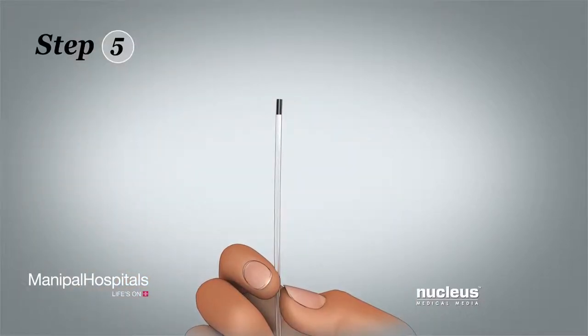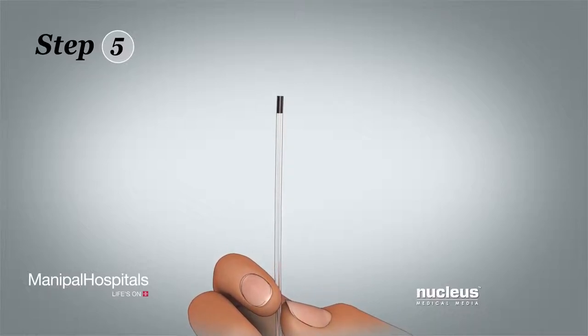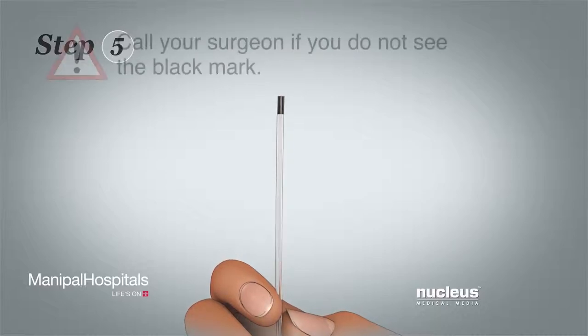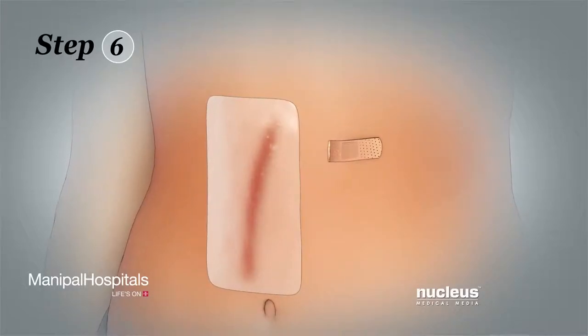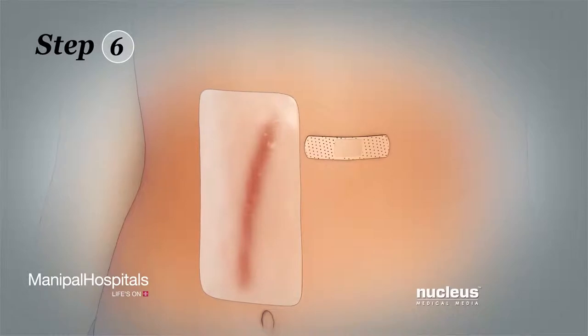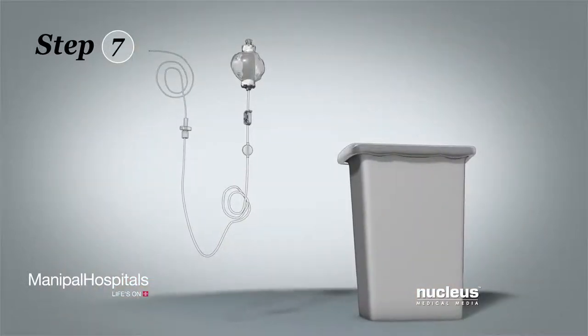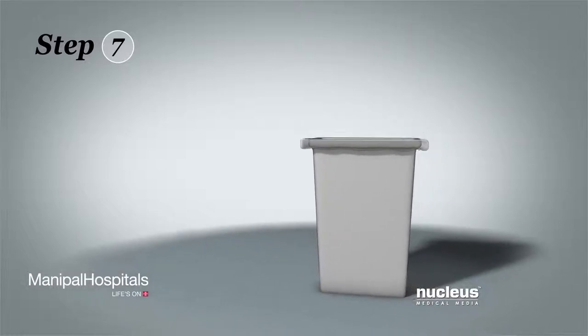Step 5: After the tube comes out, check the tip for a black mark to make sure you removed the entire tube. Call your surgeon if you do not see the black mark. Step 6: Cover the site where the tube entered your skin with an adhesive bandage. Step 7: Throw away the tube, pump, and bandages into a trash bag.